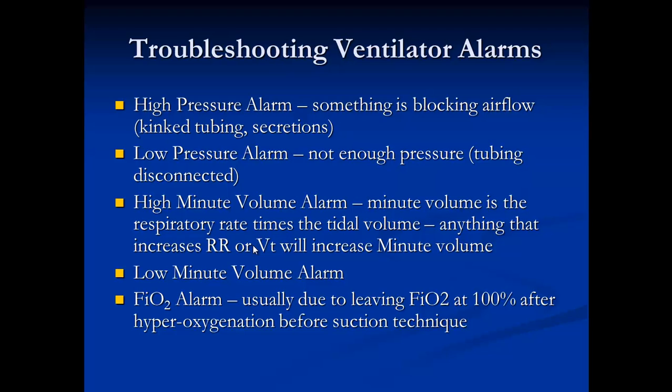High minute volume alarm means that the respiratory rate and the tidal volume are increased, so the patient is hyperventilating. So either the patient has pain or the patient is anxious or is too awake. And if the patient is not in a weaning mode or close to extubation, you must sedate the patient again. Then you have FiO2 alarms, which usually are due to leaving the patient at 100% after hyperoxygenation before suction.